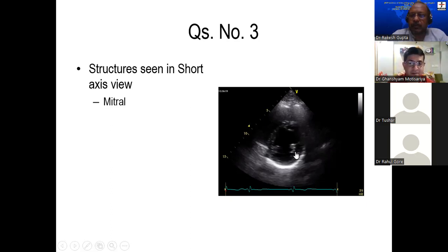Maybe this is a massive infarct along with severe mitral regurgitation. If there is no papillary muscle, only one papillary muscle, the mitral valve leaflets will not coapt with each other, giving rise to severe mitral regurgitation. These people present not only with chest pain but with acute decompensated left ventricular failure, where the LA is not able to bear the insult. It's like suddenly somebody has got severe mitral regurgitation, so the LA is not compensated at all. In that kind of situation, the only answer is immediate intervention.